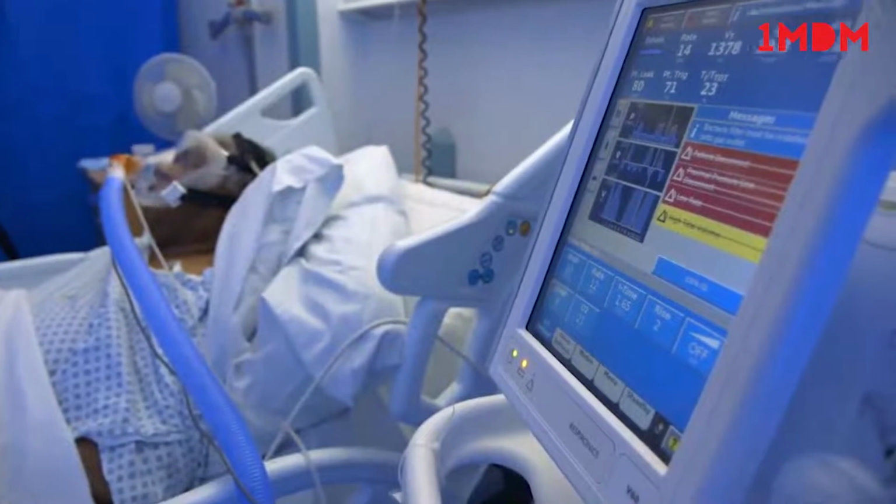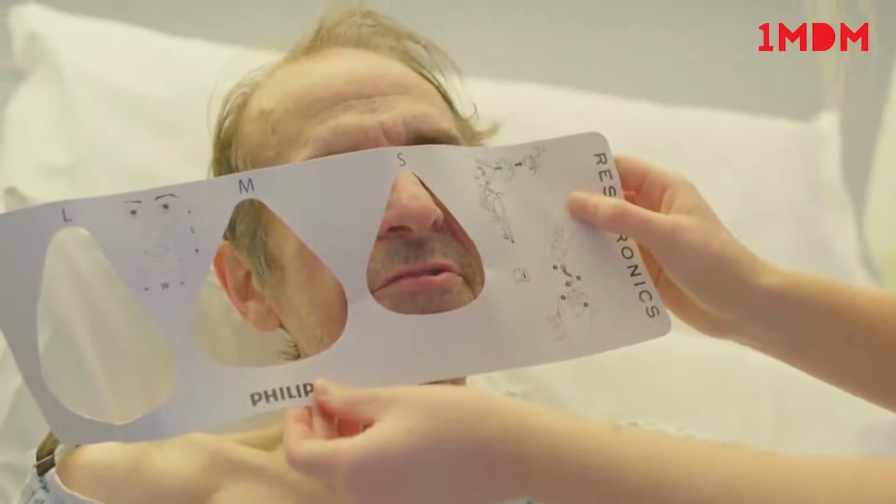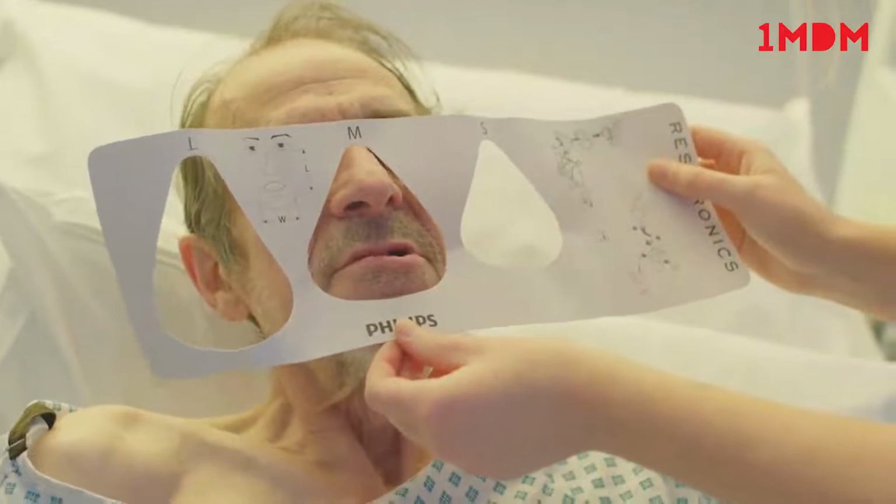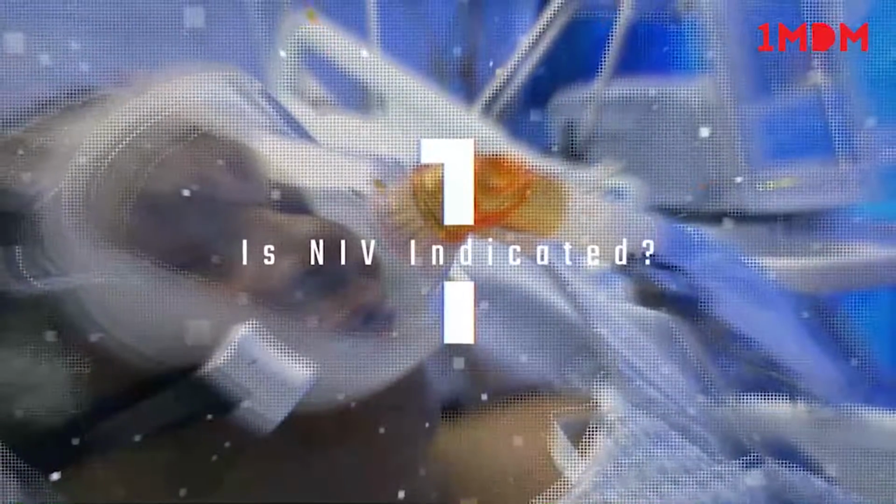the treatment. How we approach patients during NIV setup can help them understand the treatment more and be able to tolerate it better. This video is going to take you through a patient-centered setup of non-invasive ventilation. Before starting a patient on NIV, there are 5 essential things to think about.